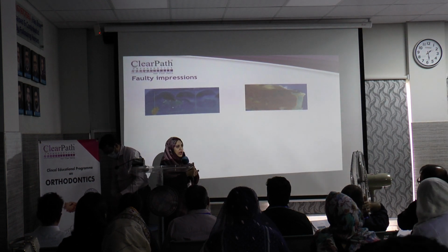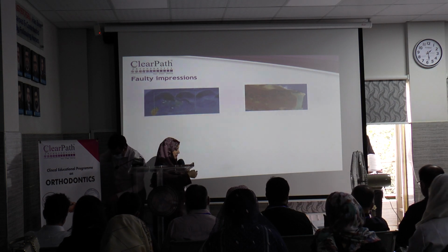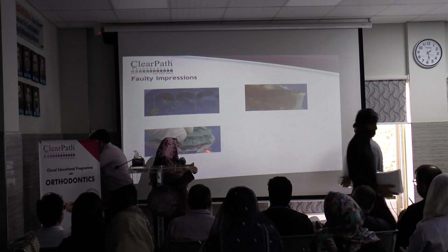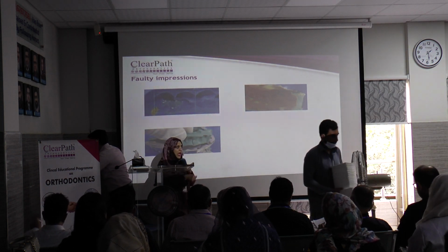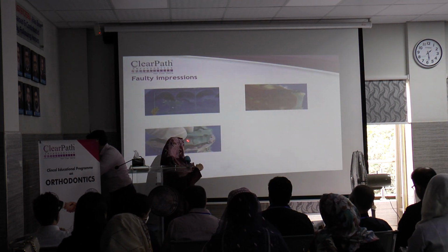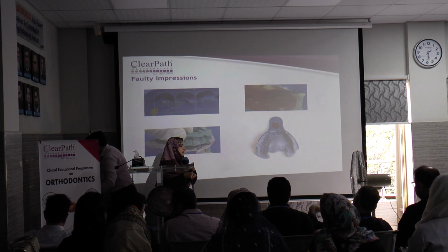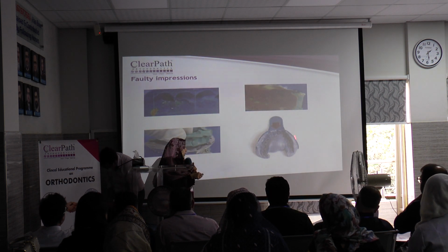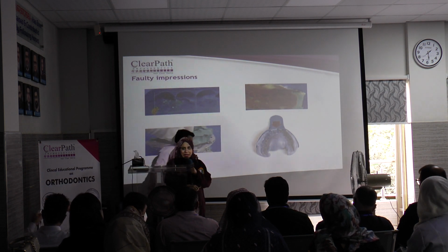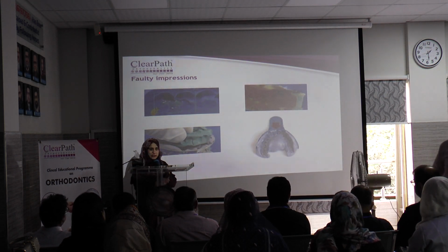7 is not visible, and inadequate occlusion morphology. You see the second molars, they have not been captured properly. This one? Improper application of adhesive. Remember, we have to apply the adhesive for the proper bonding between the light body and heavy body. So it's not properly applied, so you get a detachment. Here, labial fence is not there. You can see the tray, the visible tray from the margins. So excessive pressure has been applied on the application of the trays into the patient's mouth. I hope this is clear.